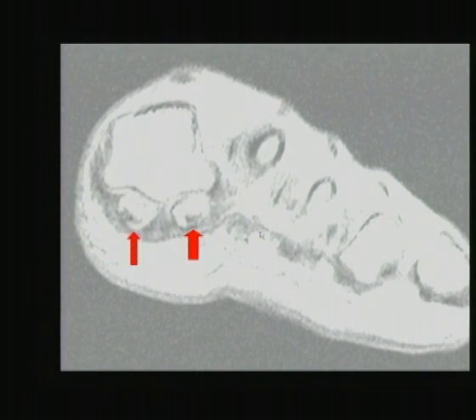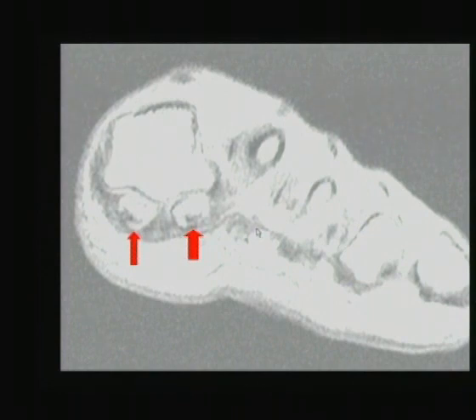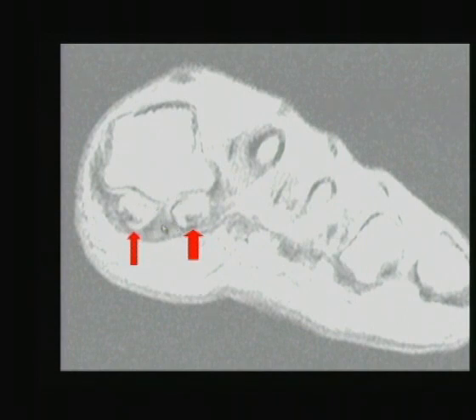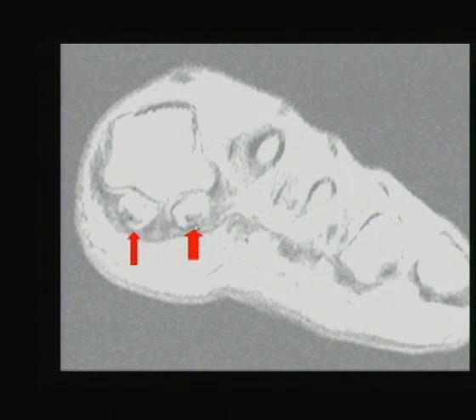A lot of technologists and radiologists disagree about what plane to call this. To minimize confusion, I always call it the short axis plane — or the 'cucumber slice' plane. Radiologists call it coronal; technologists call it axial. Looking at the anatomy: this is the metatarsal head, this is the crista separating the tibial from the fibular sesamoid, deep or plantar lies the FHL, and dorsal to the FHL lies the intersesamoid ligament. The entire structure including the FHL is enclosed by the joint capsule. The key point of this slide is the plantar low signal in the sesamoids — that is a normal or at least asymptomatic variant.